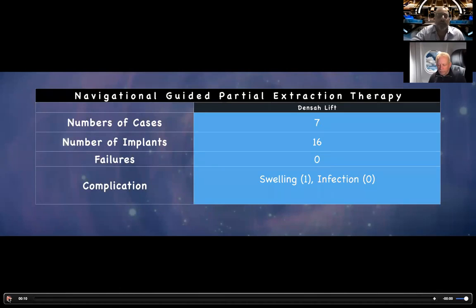we planned a crown, we scanned the patient, we made a virtual wax-up and imported it. Now we don't have to do that. Now the crowns are there. You just select the crown, change the dimensions. We can bring it into occlusion if we want. We can figure out where we're going and deliver it in a prosthetically driven fashion. And we can even go ahead and make final or temporary abutments. My latest thing is that I have a case set up for a final abutment.